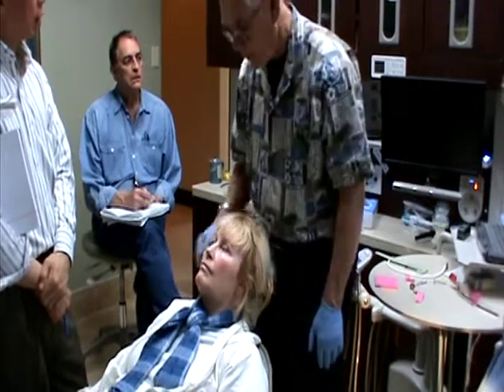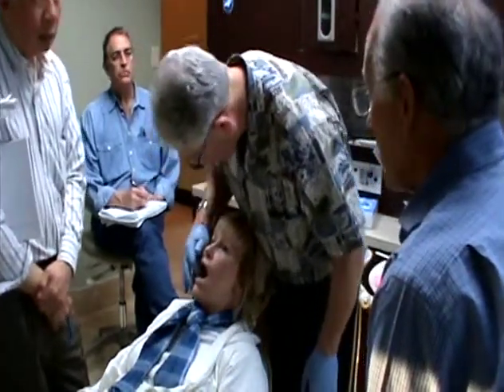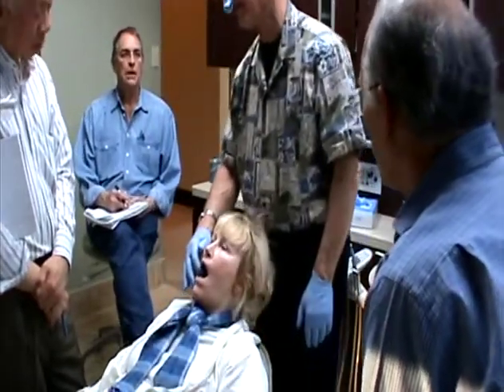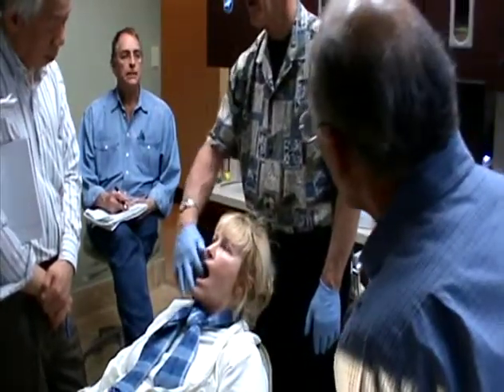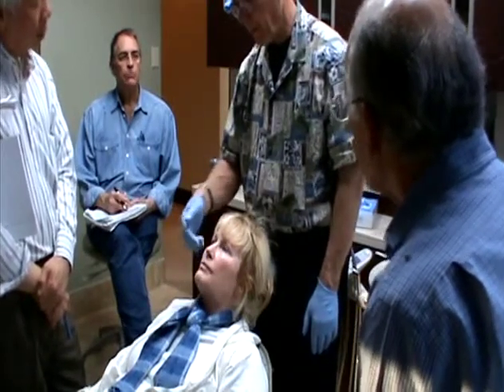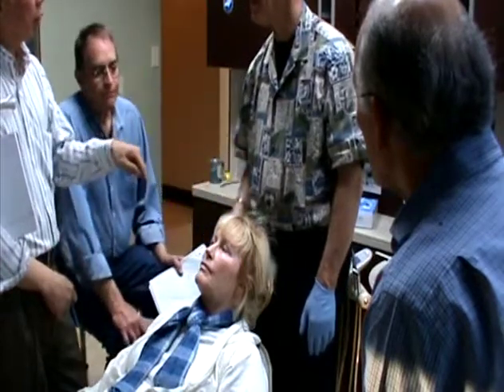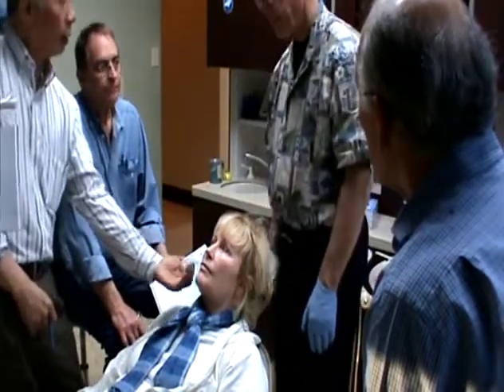Does that bother the tongue? No, they get used to it real fast. Yes, they get used to it. She doesn't have any bands on there, so you just take a button and bond it on there. Then you run your elastic from the hooks out here, under that button.